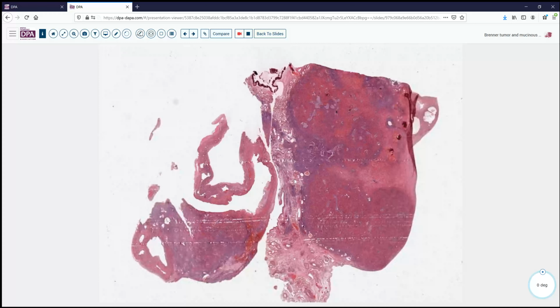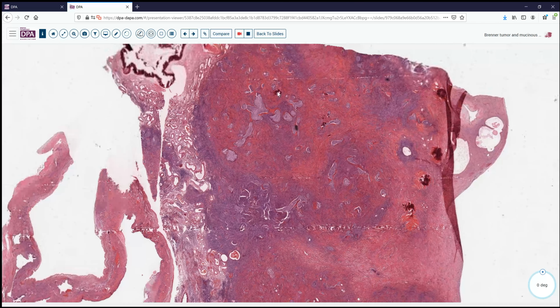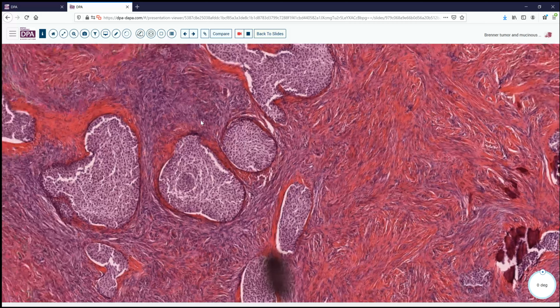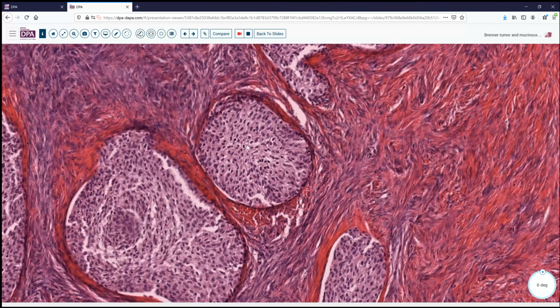Let's take a look at another one. Here we see a dense fibrotic area here. Again, little islands of epithelium. As we look at these, we see they're sort of irregularly shaped, rounded, may or may not have little lumina in a few of them, like we did in the other case. Again, we see the sort of streaming pattern of the nuclei, some clearing of the cytoplasm, prominent cytoplasmic borders, nuclear grooves. Well, you don't see them well in this slightly thick section, but characteristic of this lesion.